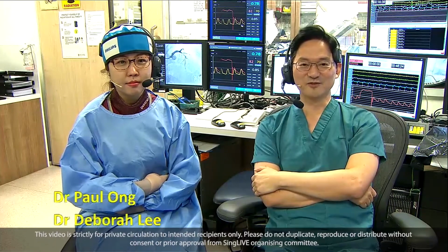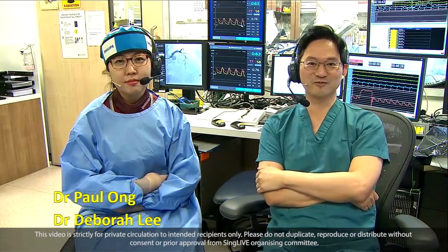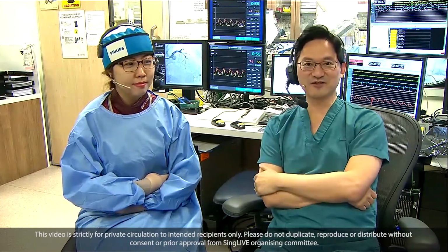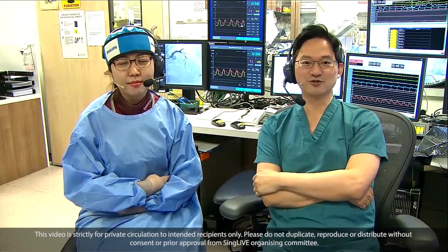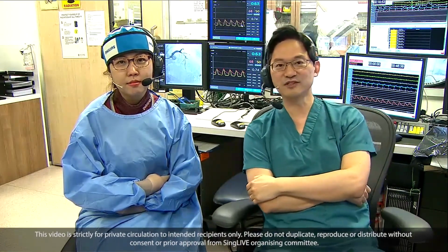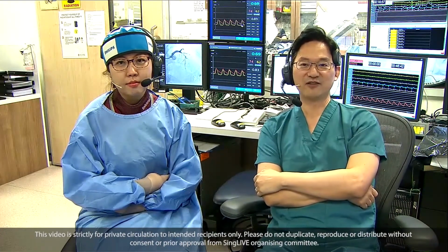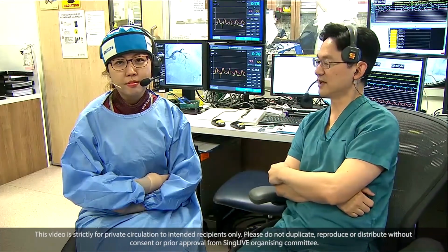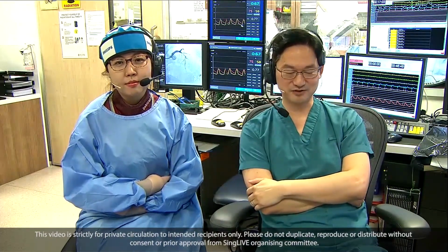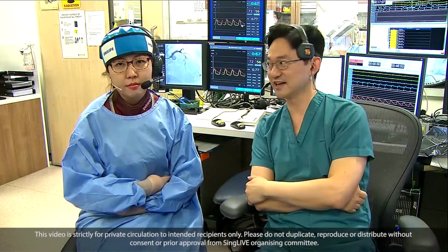Okay, welcome to Tock Seng. Been a very good conference so far, and hopefully we'll put a good show for you guys today. Together with me is my fellow consultant, Dr. Deborah Lee. So Deborah will be helping me out in the robotic room, and inside the room there is also our scrub nurse, Sister Hui Min, and also quite a few circulating nurses, Rolando, Tony, and a big team here to support us. Before we go any further, maybe I'll ask Deborah just to share the case with us first.